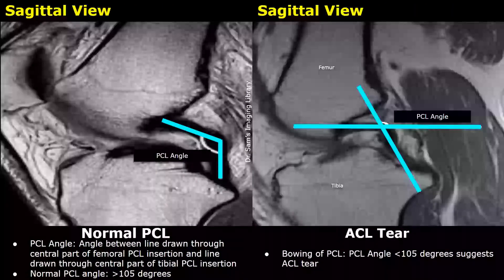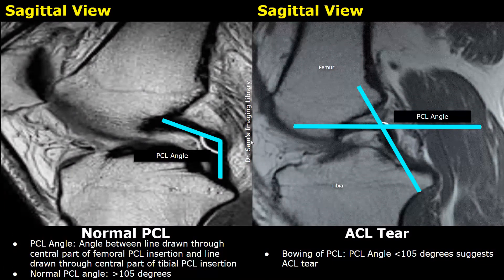This is another example showing PCL angles. In the normal case, it will be more than 105 degrees. In cases of ACL tears, due to the change in shape and alignment of the PCL, the PCL angle will change and will be less than 105 degrees.